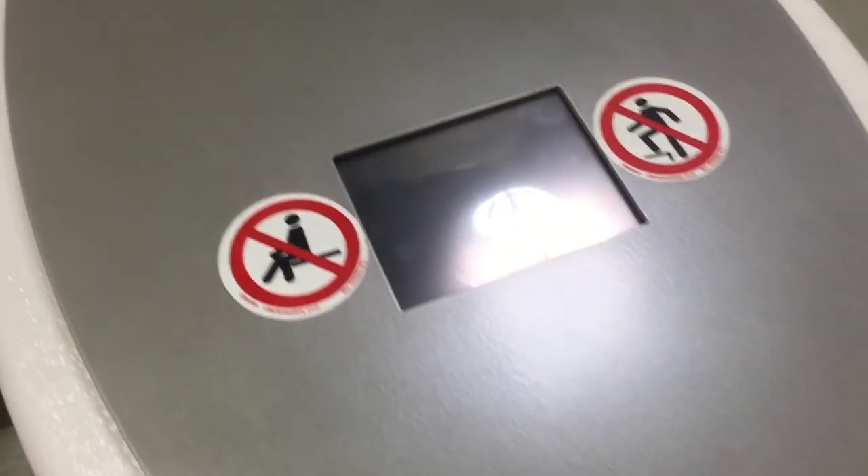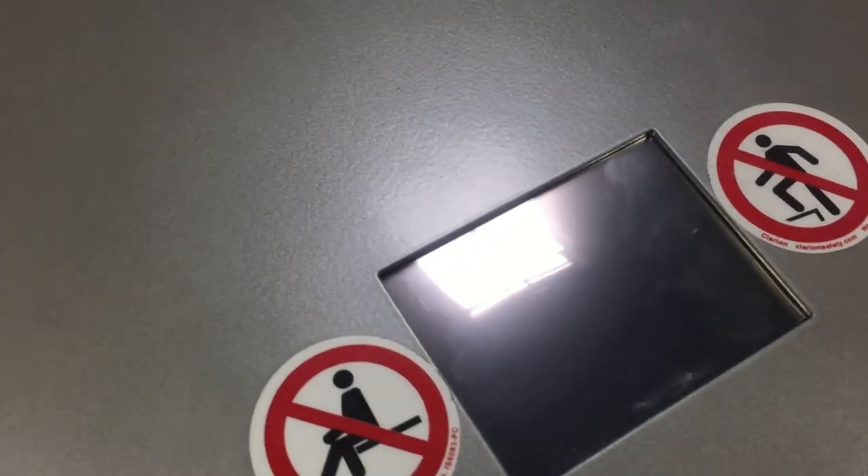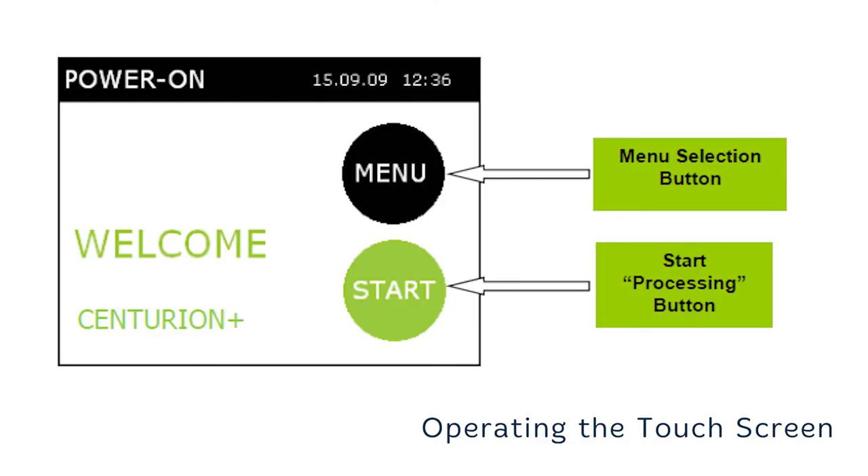On the top of the unit, you will find the touch screen display and two warning labels. You should not stand, sit on, or set anything on the unit. Do not use sharp objects such as pens to operate the screen.